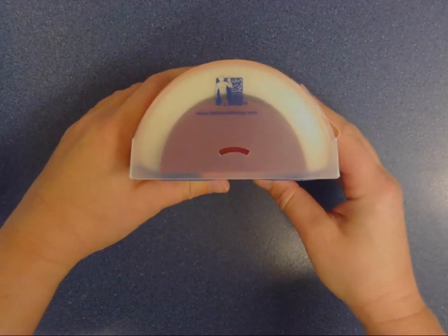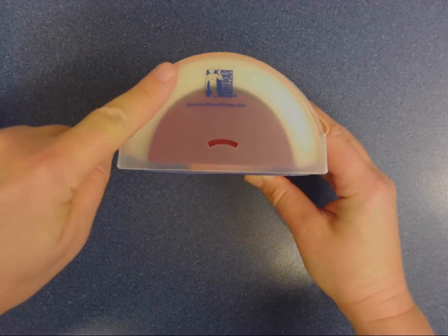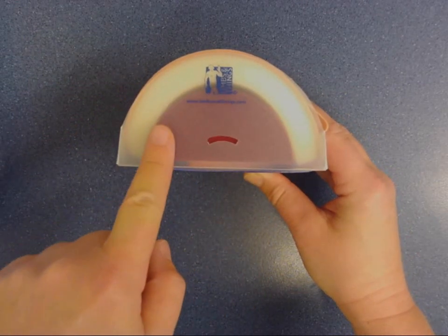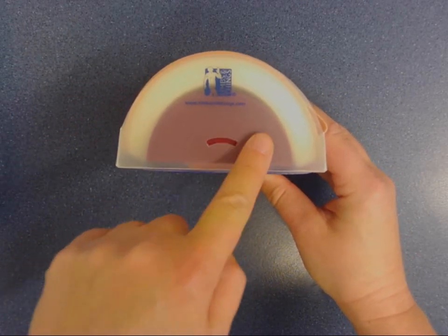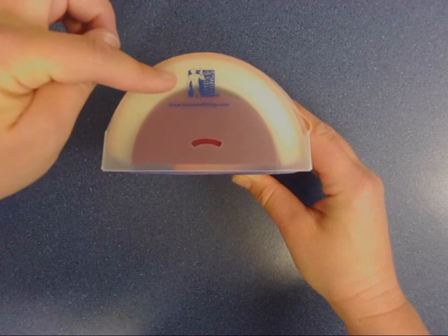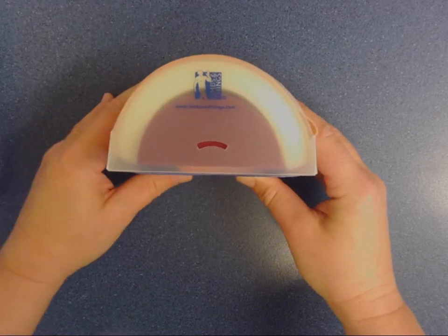On these injection pads, this is the layer of fat, the subcutaneous layer, and this layer below is the layer of muscle. We want to inject our drug into this layer of fat, so the needle we use needs to be a short orange needle.